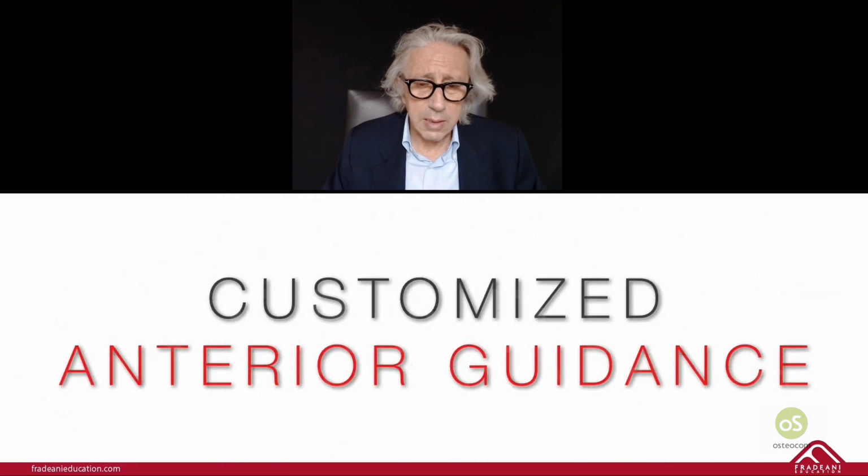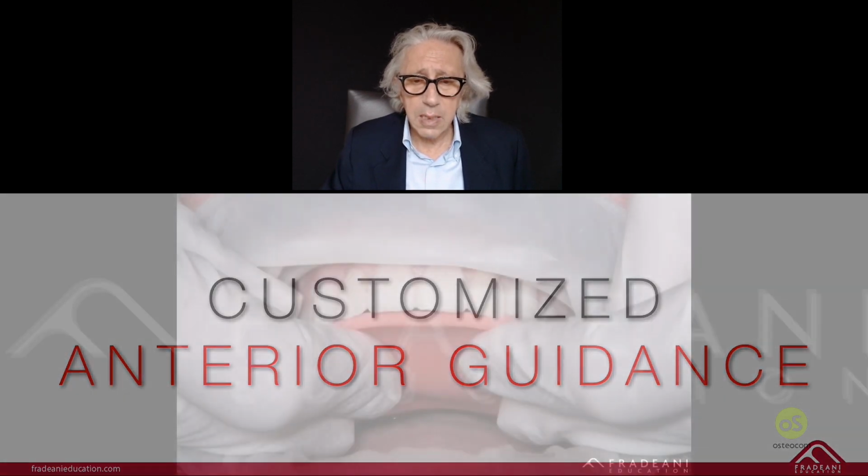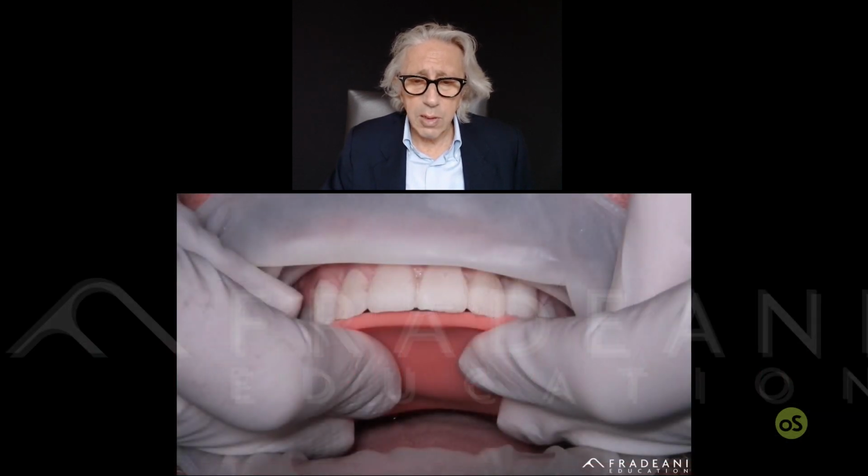So let me start. First of all, once I saw the patient moving so rapidly in a very easy way, right and left and in front, I can say, okay, I want to copy this kind of situation, this kind of movement of the mandible, anteriorly and laterally. I want to do a customized anterior guidance, and that's what I did. So, first of all, I take a bite record in CR.